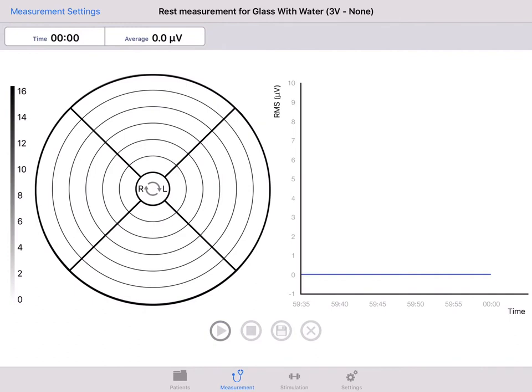On the left you see the Maplewood grid. When a measurement is started, each electrode or section of the grid will be tinted in gray scale where white is zero and black is maximal activity.